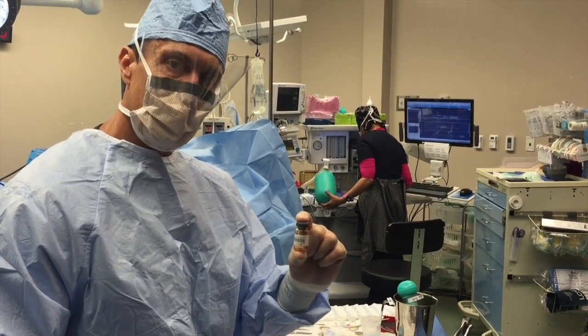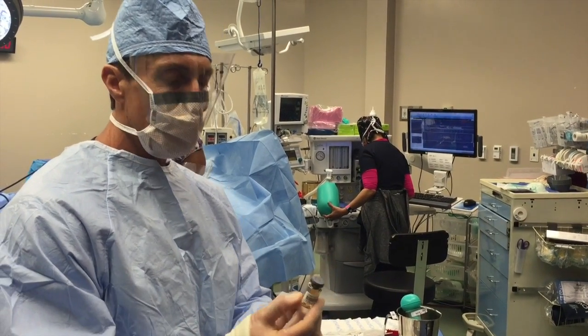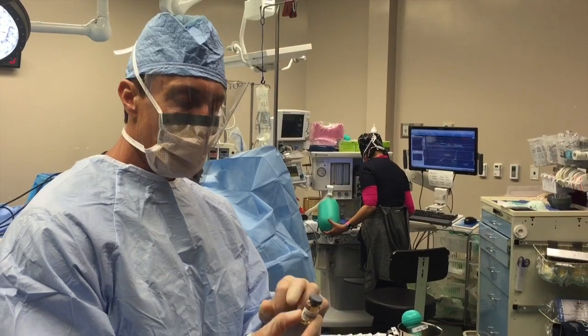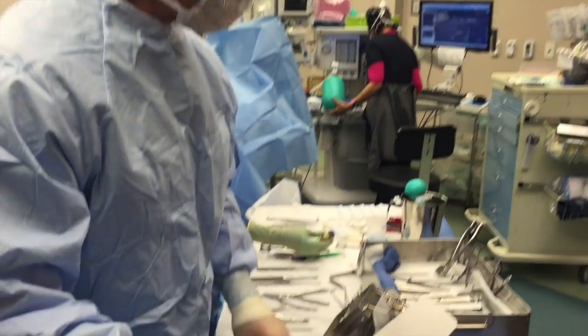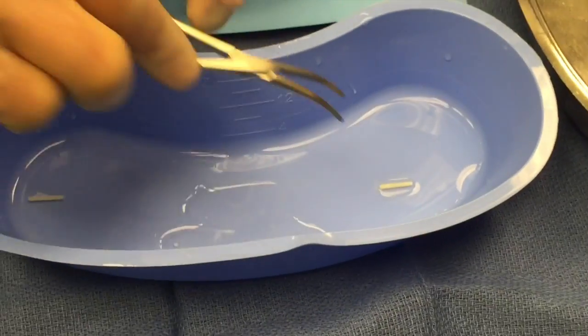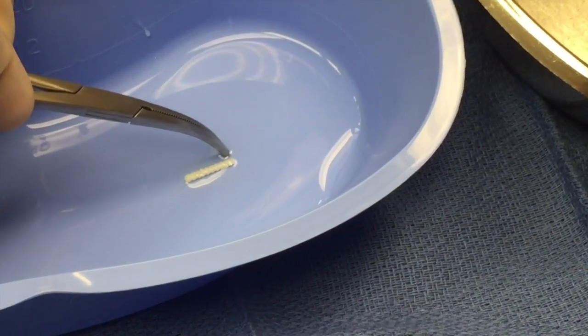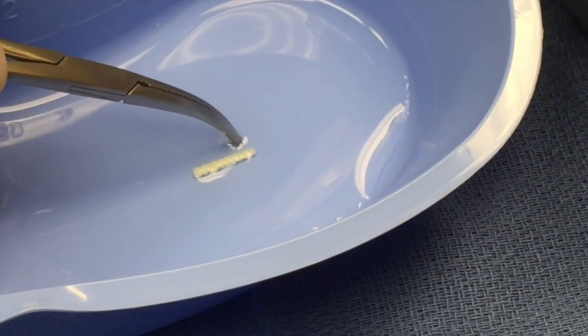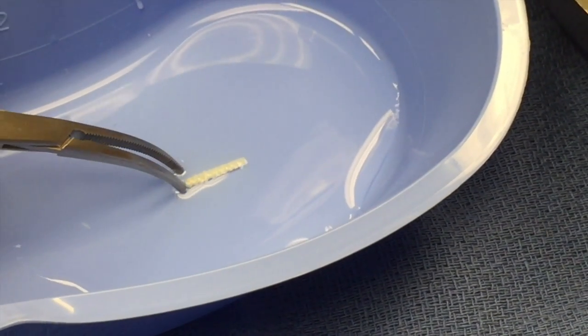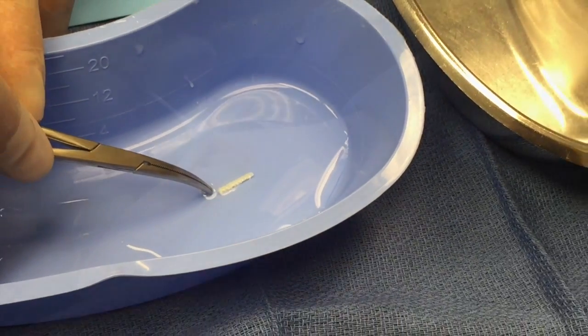Here's the allograft, or TinFuse bone pin, that I'm going to use to fixate the osteotomy. It comes in a vial full of saline with one pin — you can see them here, ready to go for surgery. If you look very, very closely, you'll see that the end here is very skinny — that's where you enter, the ridges keep it in, and then it fattens up at the tip, which is what will tamp in and be flush with the bone.